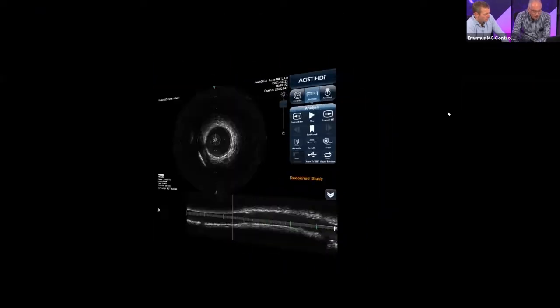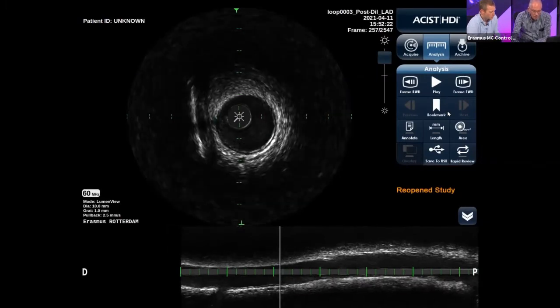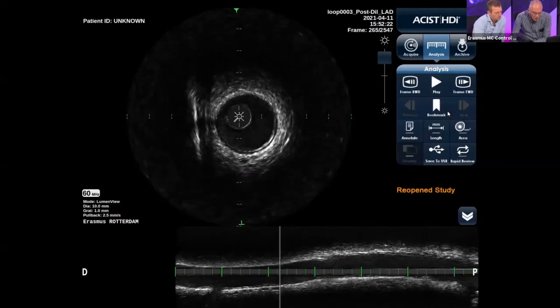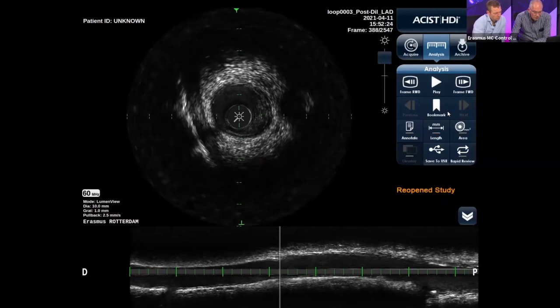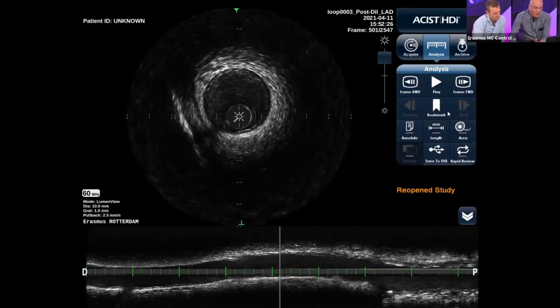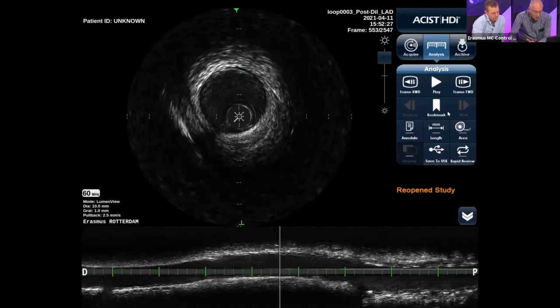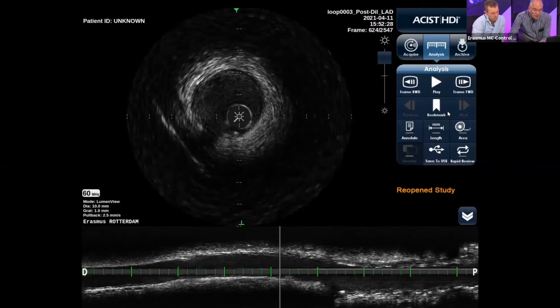Yeah. So this is the pullback after the third maneuver. It's, well, I will do by hand. So we see that merely distal from the stent, that the vessel is normal. Yeah. And what you also appreciate is now this darker aspect of the lumen. Yeah. So the sluggish flow is gone. Yeah. So there's now more flow. Probably you appreciate also that the spasm is gone.